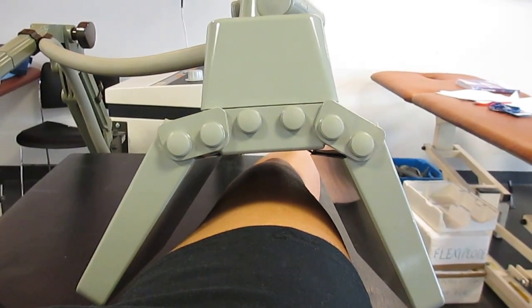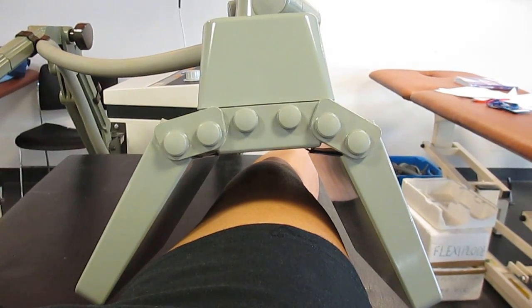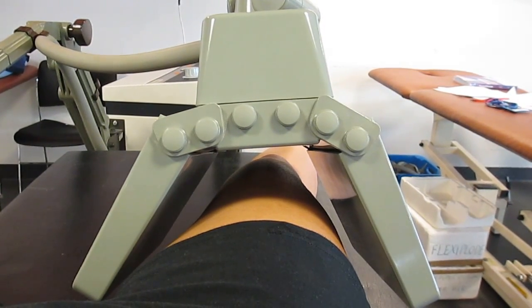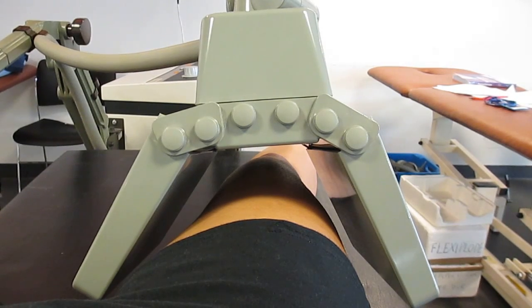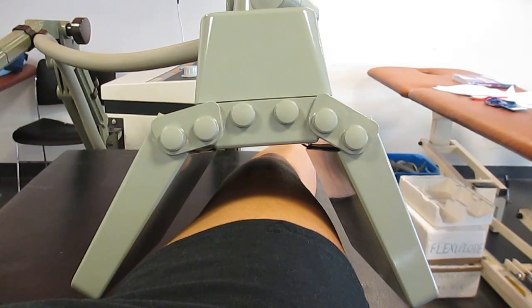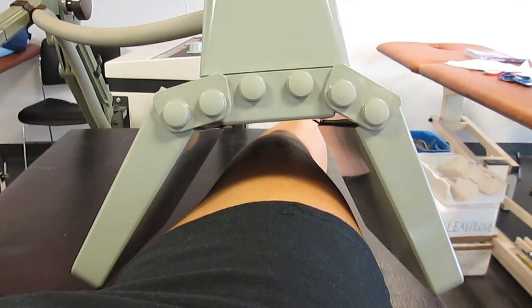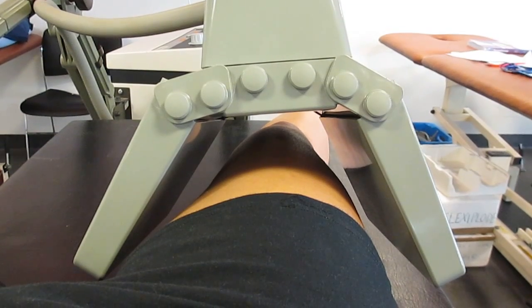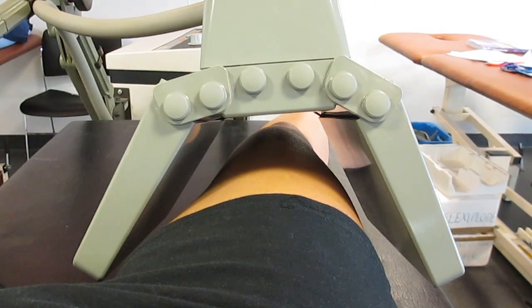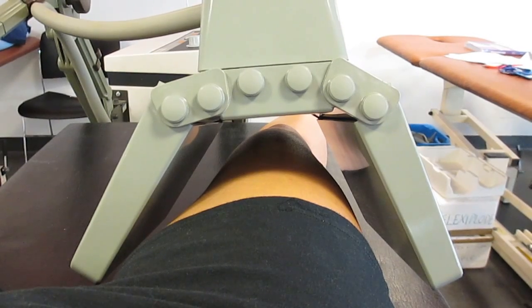Prior to doing the treatment, you need to have your patient on the wooden couch, you need to have checked that they have no contraindications, you need to expose the area that you're trying to treat and make sure that there are no metal objects or jewellery around it, and check the skin sensation using test tubes of warm and cold water.